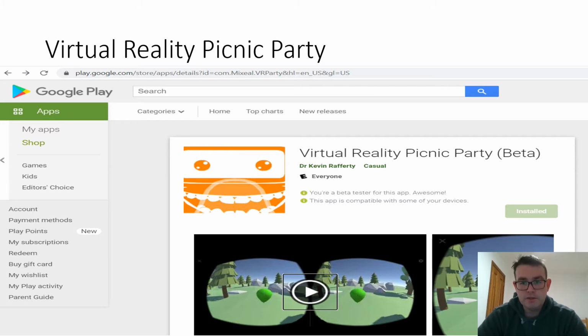And then, as the picture shows here on the screen, there's a balloon game. Whenever the child's in theatre, as the balloon on the anaesthetic machine is green, the child is blowing up this green balloon in virtual reality. The app is guided in that it has my voice chatting through each little bit, and you can use that, or you can just use the pictorial representation that you see there, but there is music and there is guidance in the app.